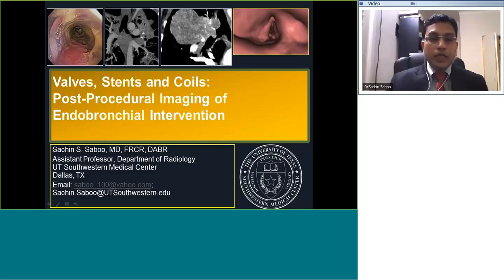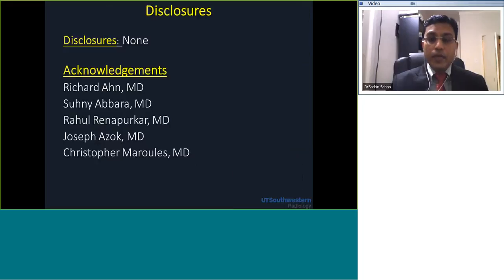I have the opportunity to present the topic of valves, stents and coils: post-procedure imaging of endobronchial interventions to you all. I am Dr. Saboo from University of Texas Southwestern Medical Center in Dallas. In the next 30 to 45 minutes, we will be talking about the imaging of the endobronchial interventions.